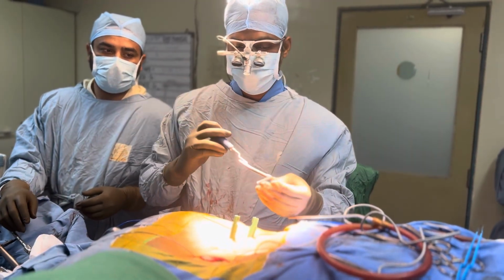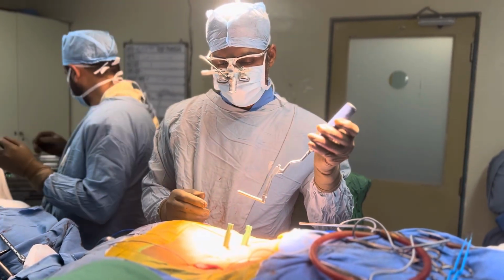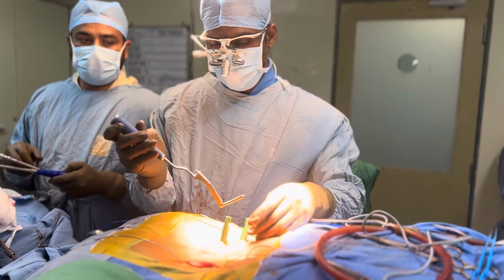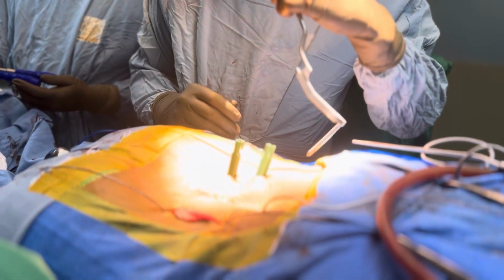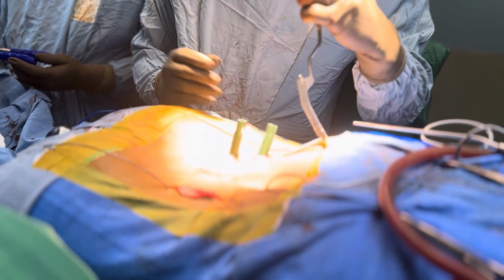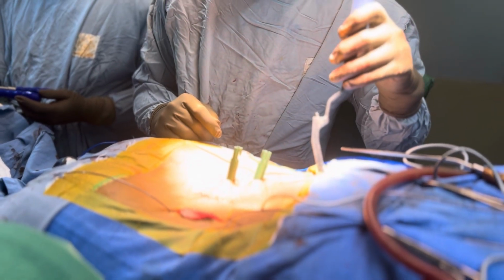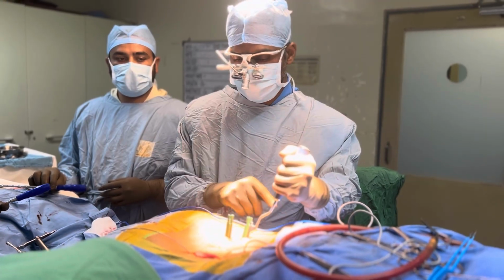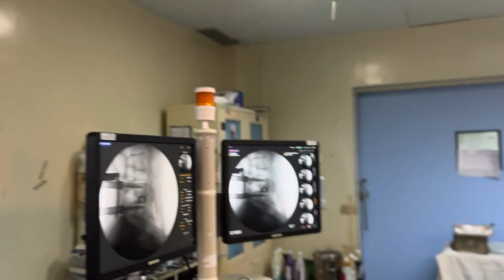They are already pre-bent a little bit, and there is a handle to attach it, and you can insert it from above down or below up. So I prefer to insert it from above down. It should go below the fascia, so you can remove the C-arm and you can put it under vision. Now the rod is inserted from proximal to distal direction, or cephalad to caudal direction. It is confirmed on the C-arm on lateral view.